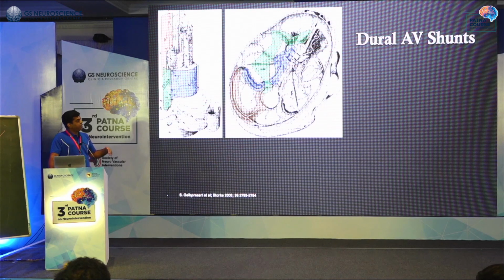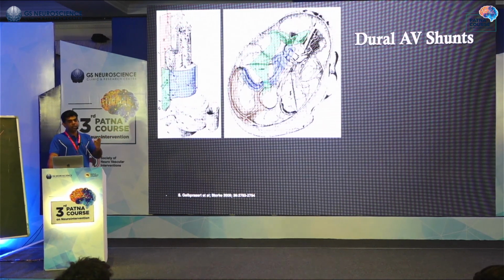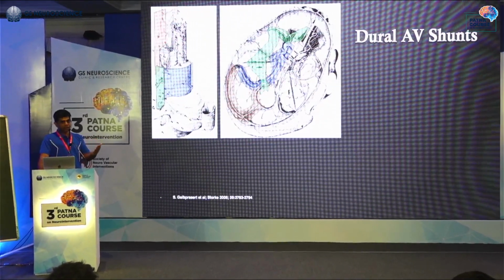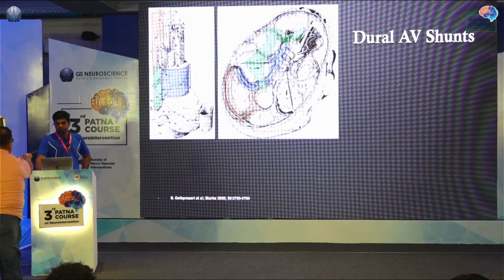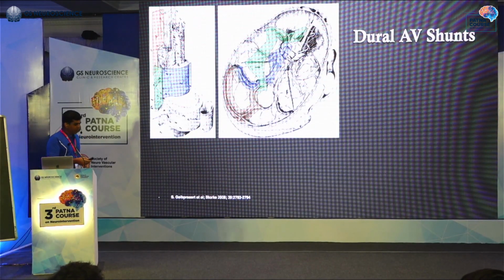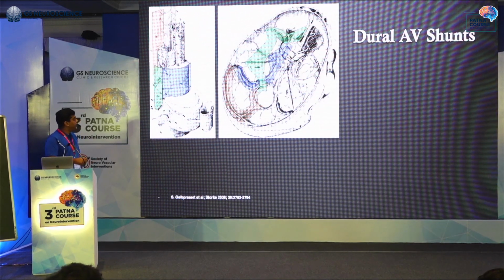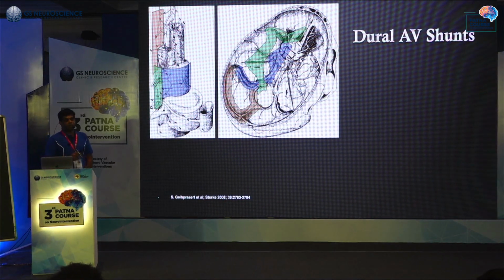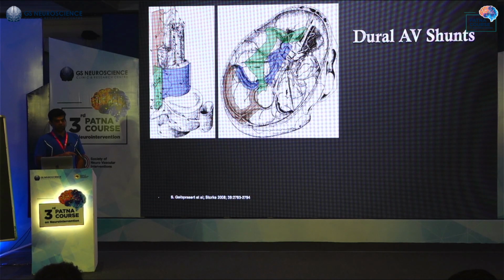Similarly, the ventral ones, shaded in blue, all have their own venous drainage which runs ventrally, and they don't come to clinical attention. These fistulas we see when we do random angiograms; we could pick them up. Whereas the lateral ones, cranially as well as in the spinal cord, don't have exclusive venous drainage extradurally, but invariably drain intradurally.